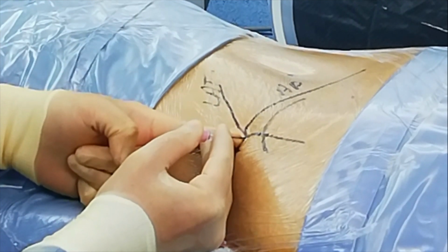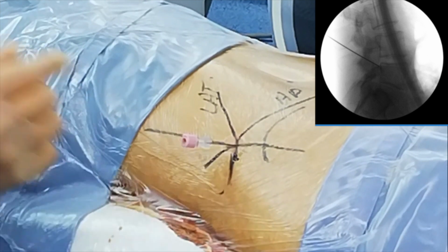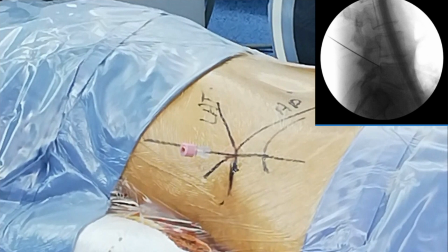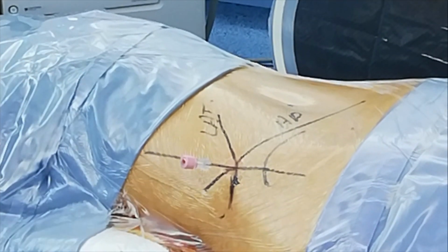X-ray. X-ray. Okay, so I'm in the posterior upper corner of L5. AP please.